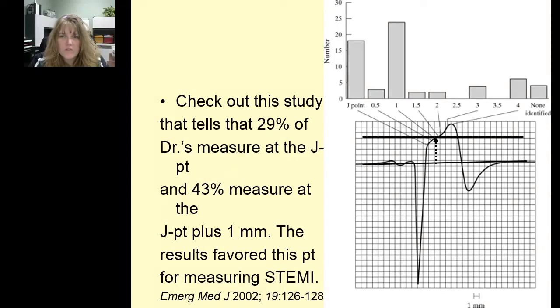So I don't believe this is really the best slide to do this type of presentation with, but it's what the state provided us. I am going to provide you with some other PowerPoint presentations that I've done that may give you a little bit more clarity if you have problems identifying the J point. But in this picture here you can actually see where the Q drops into the R, and then you move up into the S, and you see a little bit of an upstroke or a little slur up, and that's moving your S into your T wave.